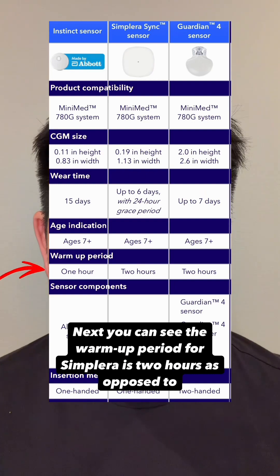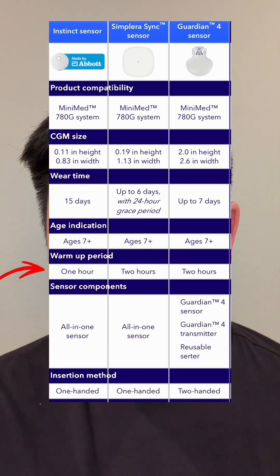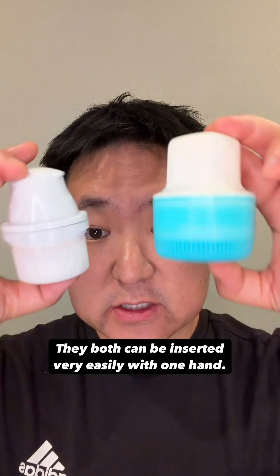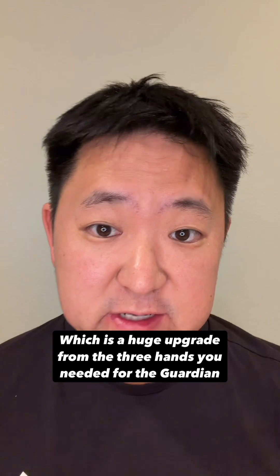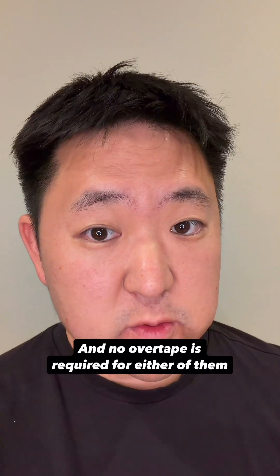The warm-up period for Simplera is 2 hours as opposed to the Instinct's 1 hour — decisively in favor of Instinct. They both can be inserted very easily with one hand, which is a huge upgrade from the three hands you needed for the Guardian 4, and no overtape is required for either of them.